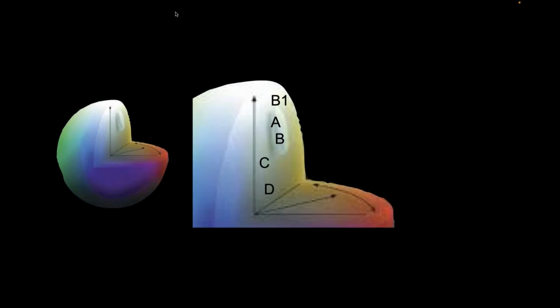So most of the shades that you work through fall in the A range, A1 to A4, and in the B range, B2 to B4. Those are where the most colors of teeth come from that we usually utilize when we're restoring teeth. Does that mean that I never use a C or a D shade? No, I do, but I don't use it probably the way you use it. I use it more to absorb or reflect light, manipulate the light effect of my restorative, rather than just use it as a specific shade.